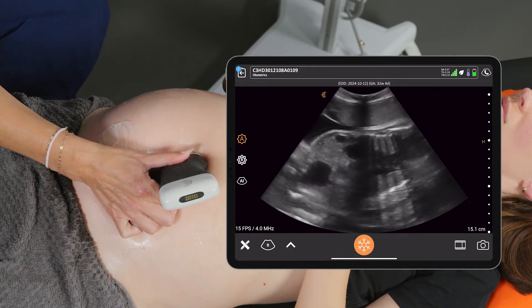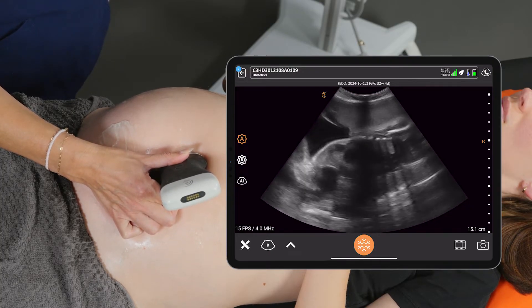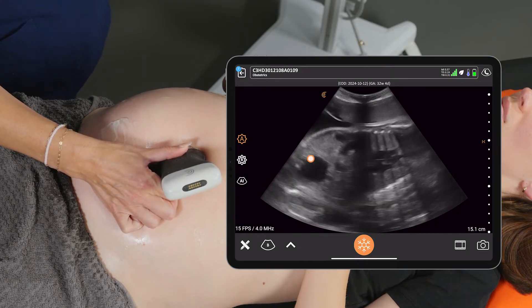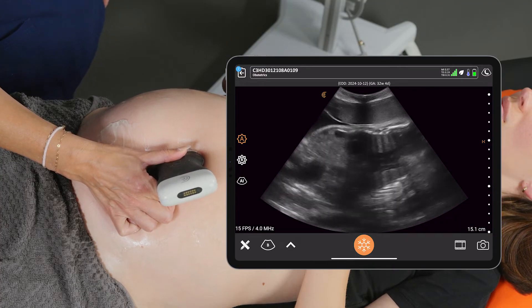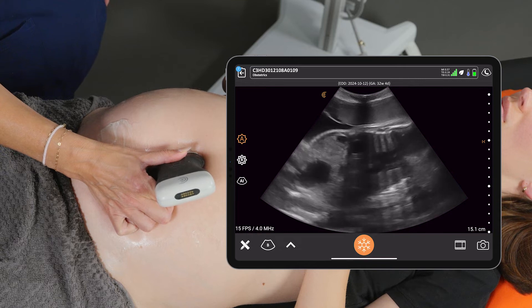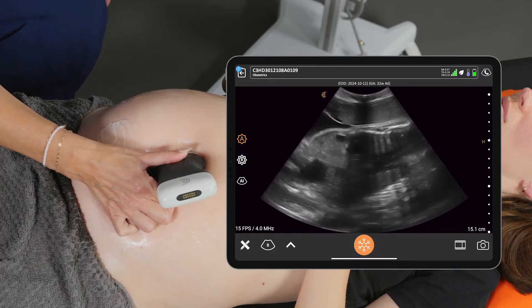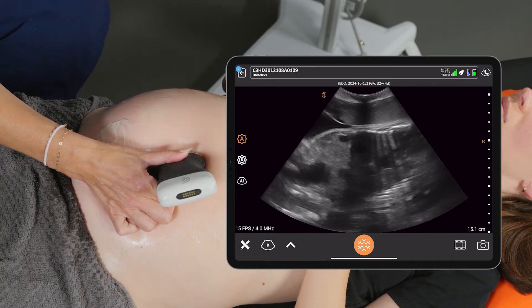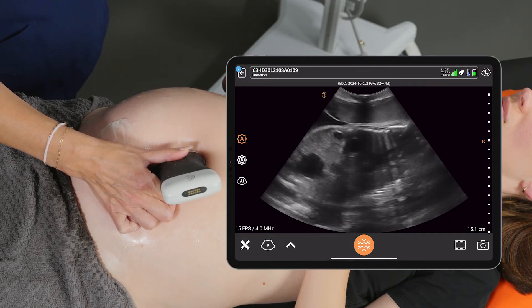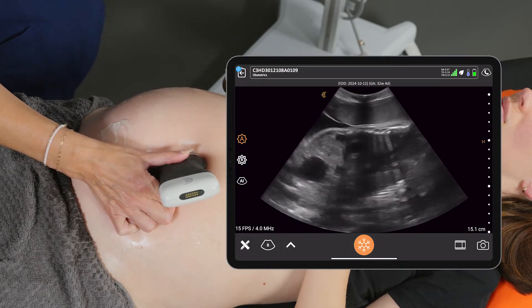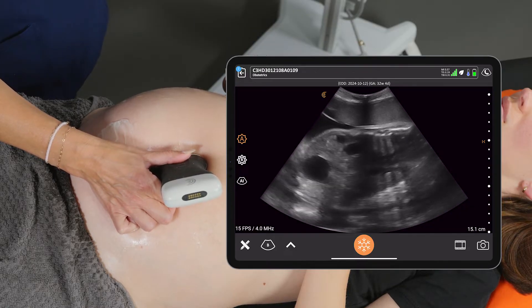Here we can see the sides of the baby's torso contracting as the baby practices its breathing motion. Down low here is the baby's bladder, the stomach, and the heart. That in-and-out motion is the baby practicing the breathing — taking in amniotic fluid through the nostrils and practicing how to breathe. We can see the abdominal walls moving on the sides, and we want to see this continuous movement for 30 seconds to adequately pass the fetal breathing portion of the scan.